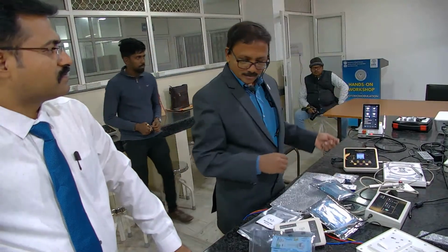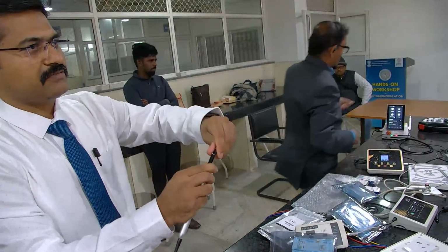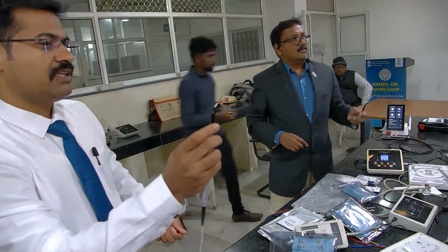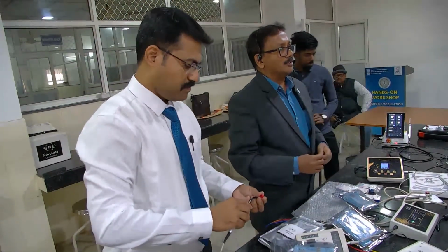8 mm or 3 mm. This is the 8 mm tip. We have something called auricular tips for auricular medicines. You can go for a 3 mm or 8 mm. Anything you have at your disposal, you can use it.